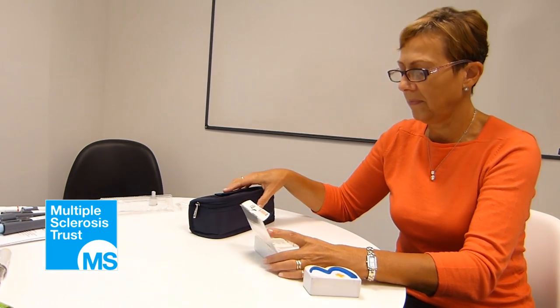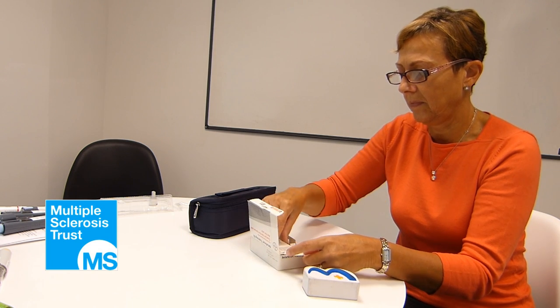To prepare Beta-Pheron, gather all your equipment together, making sure you use a clean table and surface and you wash your hands thoroughly.